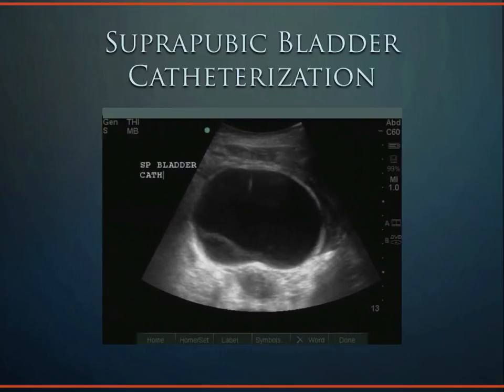It's actually called percutaneous. Whenever you go through the skin, it's called percutaneous. So what we did here is we took a needle and we put it right through this skin and some of this fat here and the muscle. And you can see the needle tip. Do you guys see that needle tip right there in the bladder?